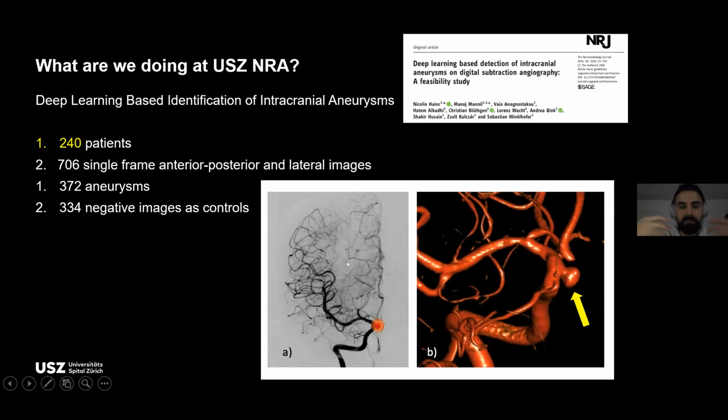For those who are not familiar with radiology, these are images where the interventional neuroradiologist injects a contrast inside the vessel, and then we take the image with X-ray. Basically, what we are looking for is abnormal bulging of vessel walls, such as we see here. It's called an aneurysm. The 700 imaging data sets were divided roughly in half, those with aneurysm and those without.